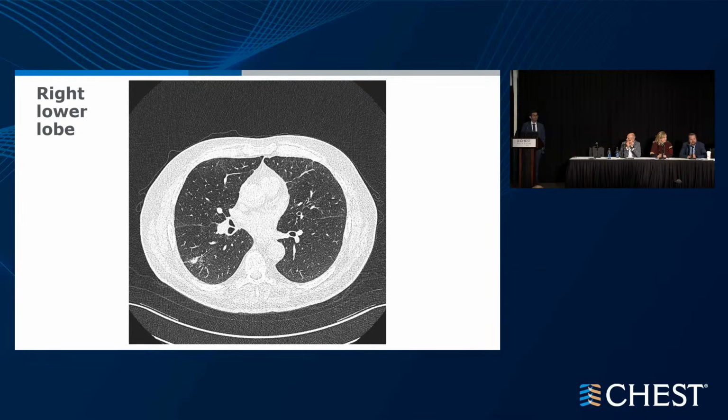And how do you talk to your anesthesiologist about getting access to 2R when you do your late stage? Yeah, I'd either pull the ET tube back at the end or swap it out for an LMA at the end if I can't reach it. It's important to have a conversation with anesthesia before you even get started and let them know what the process will be, and the on-site findings will drive it. I find if you have that pre-conversation, it goes quite smoothly. But it does require that conversation.